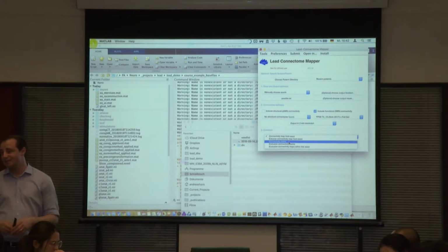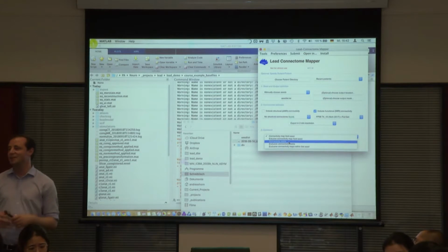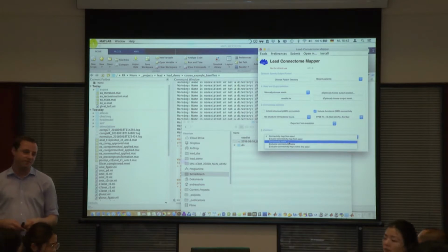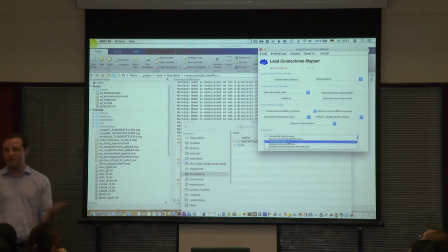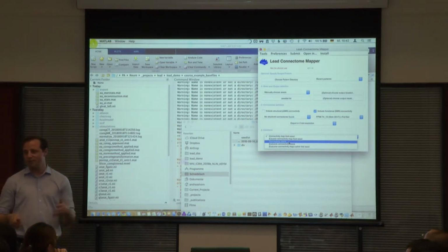I would think so, because it would inform you of what that region would be on average connected to in your brain. But it's a different type of information, of course. It's a bit like whether you look if it's in the atlas STN or not. So there is a limitation, and you have to assume that your patient is similar to the average connectivity, but then you don't have the noise problem.